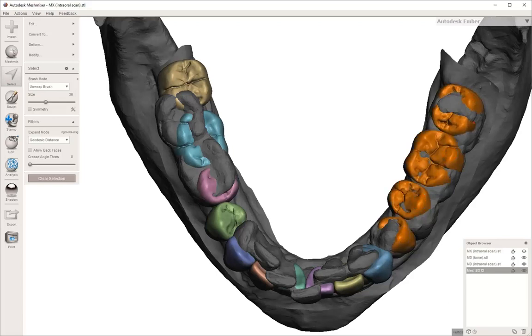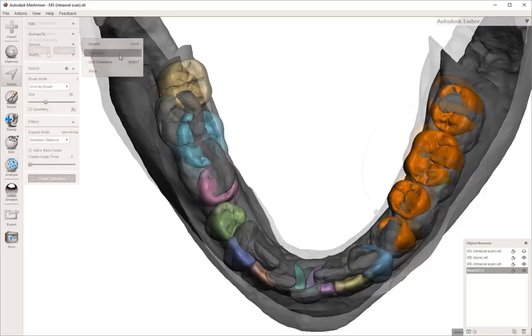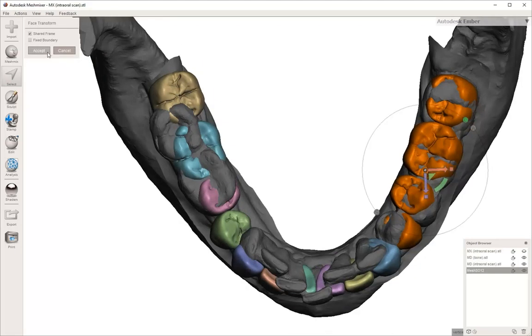After you do that, you can use the expand the connected tool, which a shortcut for that is E on the keyboard. And then after that, if you type T on the keyboard for transform, it's going to allow you to move just those teeth that have turned orange.